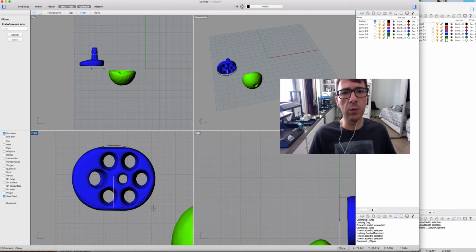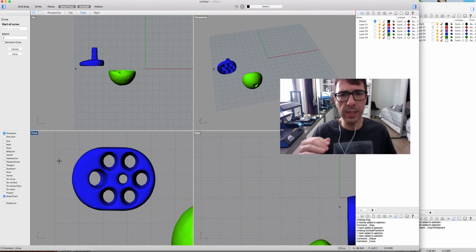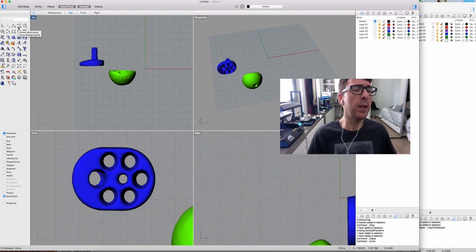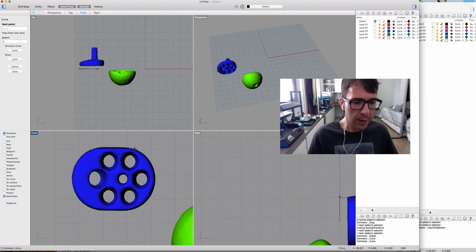This would be perfect. This would be very easy to do, but I'm going to do it in a different way, a more step-by-step way. So I'm going to change the curve here on the right top, left top, and I'm going to point and click around the implant, just as I want. So we know that here we have a flat part, and here we have the round part.